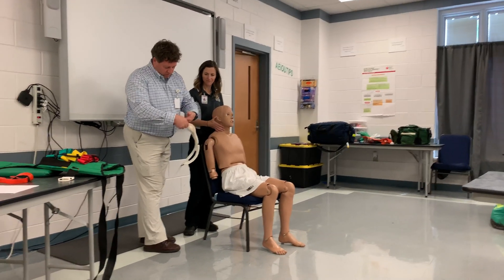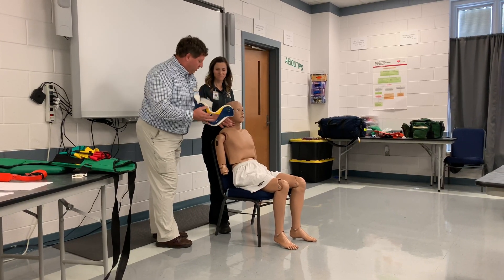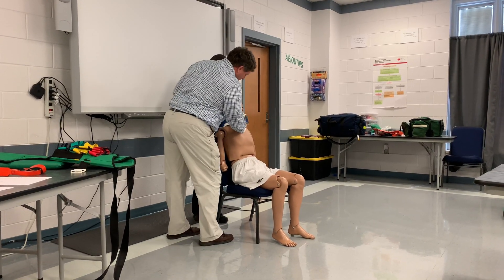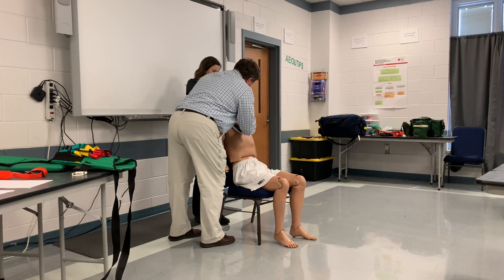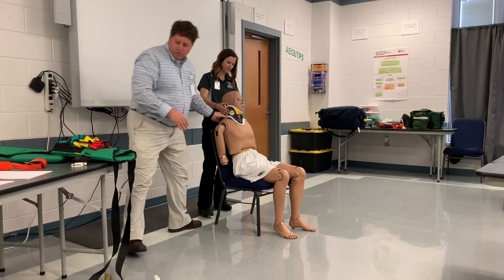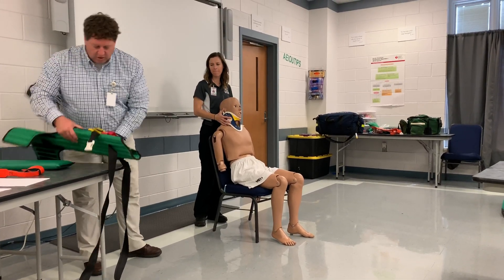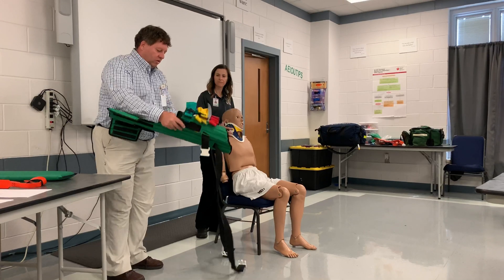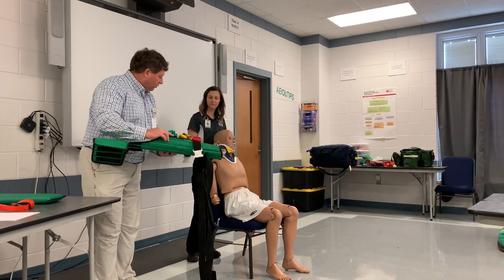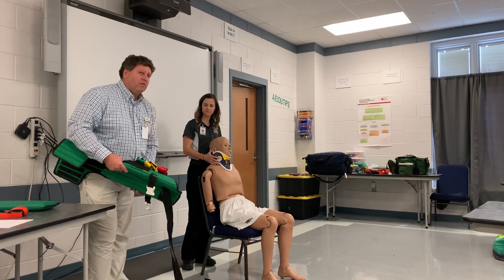I cheated a little bit - it was on just a moment ago. Put the C-collar on. The partner is still continuing to hold spinal stabilization, and then I'm going to slide the vest behind them. This thing is going to wrap around underneath their arms. I have to get behind them somehow, so I don't want to move them too much, but I might have to move them a little bit.